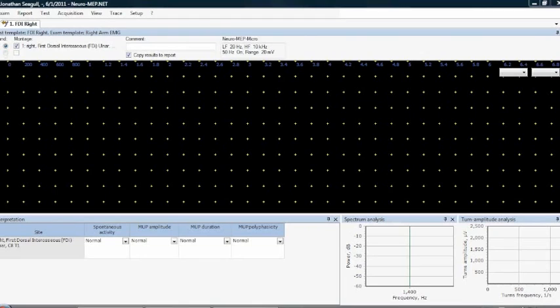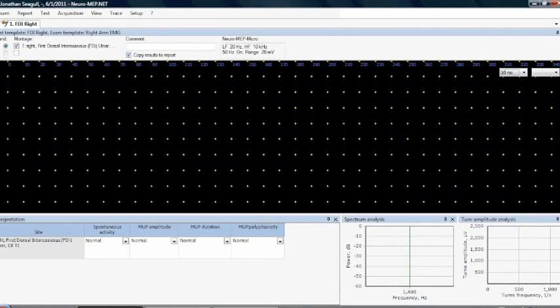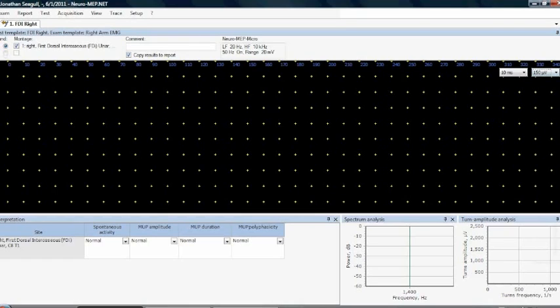First of all, this is the screen that shows you where the motor unit potential is going to be displayed. Here you can set up the sweep speed that you want to use. I usually use 10 milliseconds per division. And let's set up, for instance, the gain that you want to use. I usually use anywhere between 150 or 200. Let's say 200 at this point. So this is a screen that's going to display this right now, as you can see. And it's going to tell you you're doing the right first dorsal interosseous muscle. It's ulnar innervated and C8-T1. It shows you the filters that you'll be using, 20 hertz for the low filter, high frequency is 10 kilohertz, and so on and so forth.